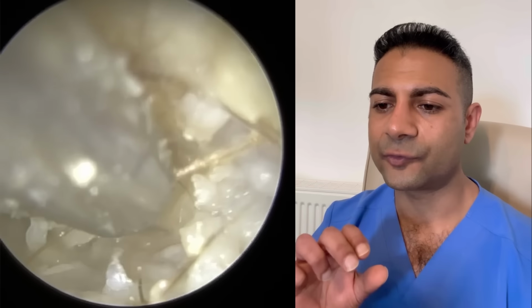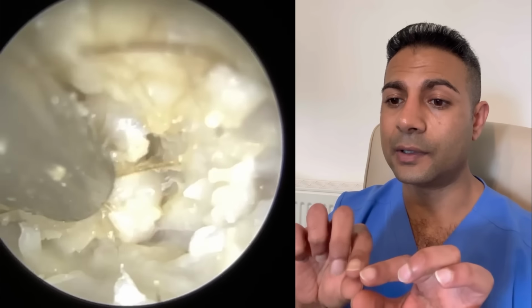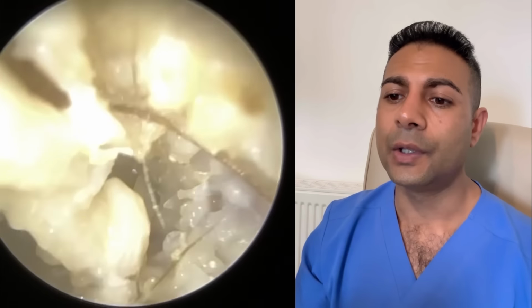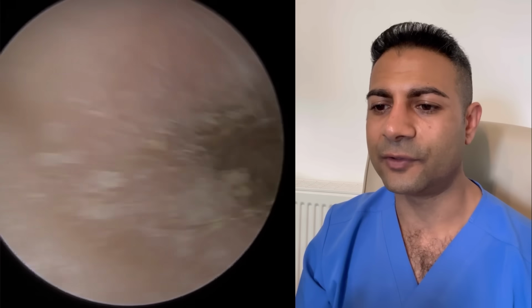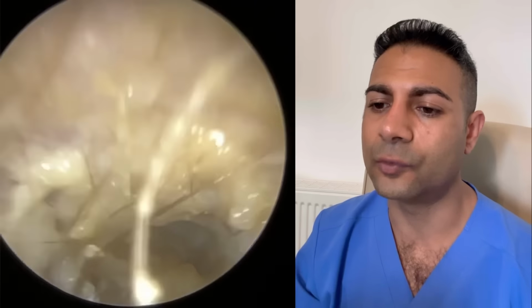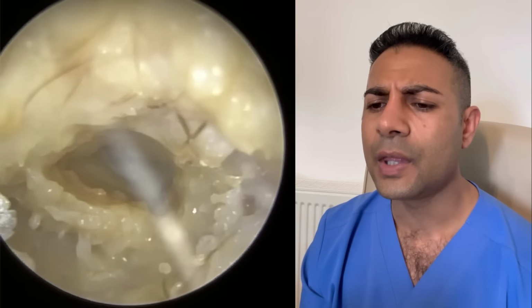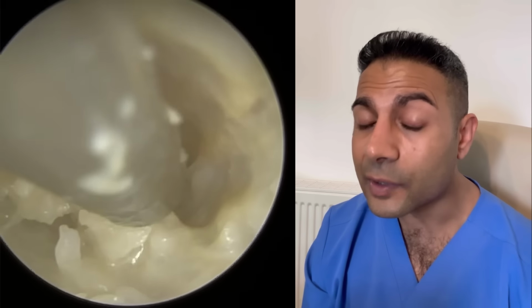But when the individual skin cells are still interlocked, which they are here, because you can see you've got chains almost, layers of skin, and it's not fully off the canal wall because this is still semi-adherent, I would call this squams as opposed to desquamous. And it's quite typical with a fungal infection actually.